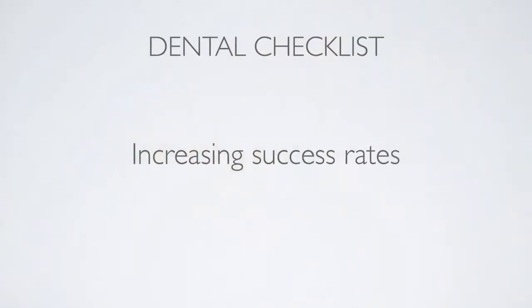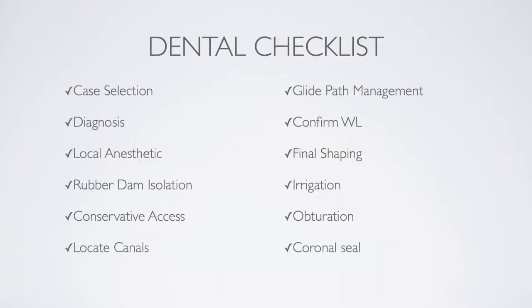Checklists can be used for an array of tasks, from the simple grocery checklist that makes sure we don't forget items as we pass through the aisles, to as vital as a pre-flight checklist that makes sure our airplanes are safe to fly across the world. Here we will use it to make sure that we carefully progress through the procedure in a meticulous manner. These are items that need to be taken into consideration on every case to make sure we are thorough in our therapy. In this video segment, we are going to review the first 4 items on the checklist.